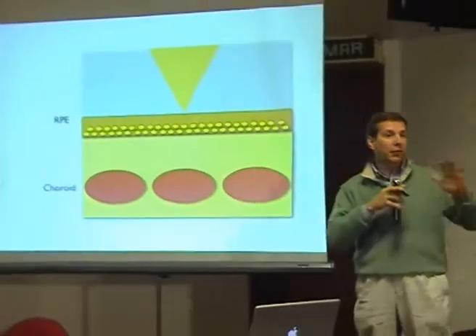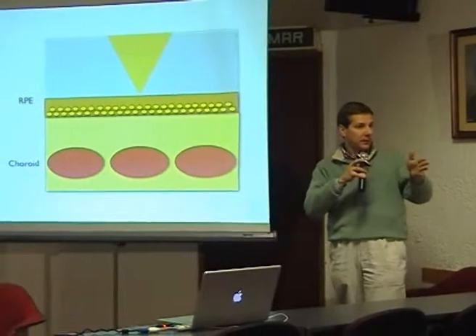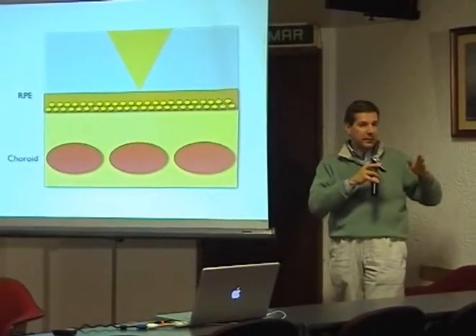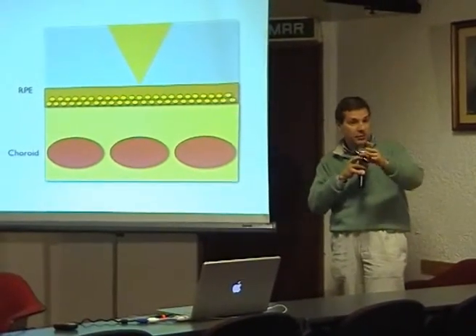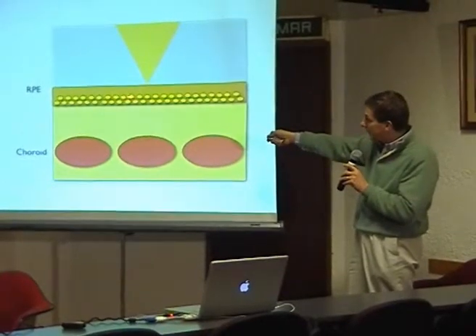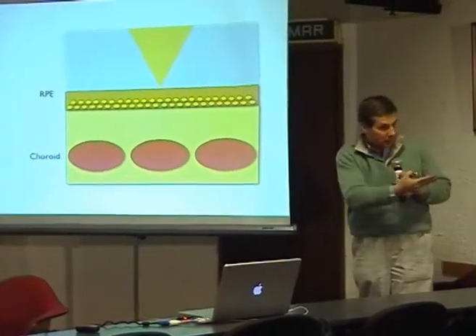You know what fluorescence is, first of all. If you use a light, you create another light at a longer wavelength, and it gives some information. The difference between a reflection image and an autofluorescence image is that with a reflection image, a red-free image for example, you take the light and you record the light that comes back, reflected by your layer.